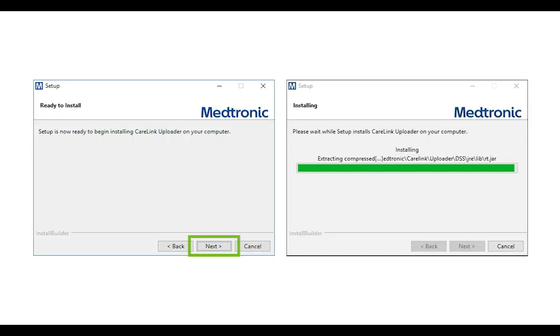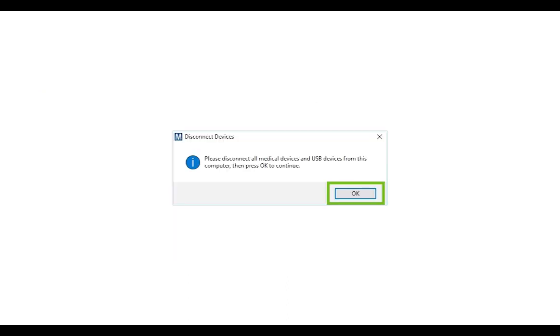Then, select Next to continue and begin the installation. When asked, make sure that your CareLink USB or meter are not plugged in and select OK.